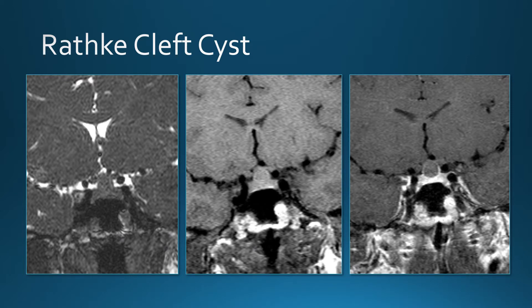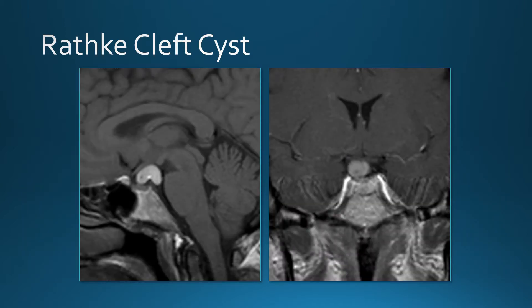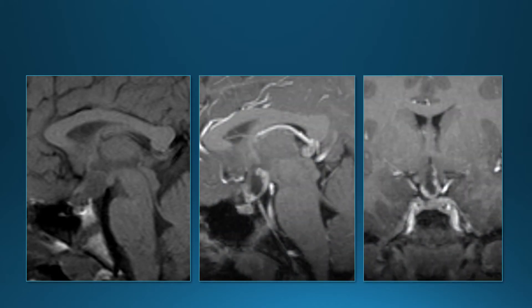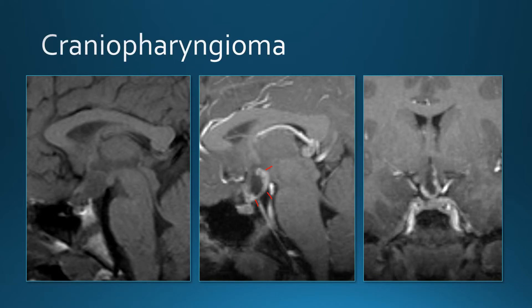Another Rathke cleft cyst, and another one that's very bright on T1 with a somewhat unusual shape. Another suprasellar mass — bright on T2 and bright on FLAIR — could it be a Rathke cleft cyst? On T1 post-contrast this one has nodular enhancement in the wall, which means it's not a Rathke cleft cyst. This one is a craniopharyngioma.